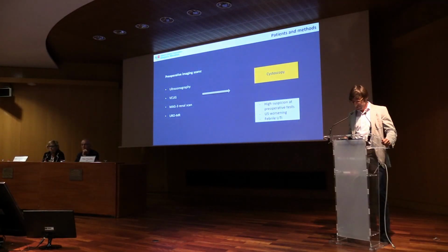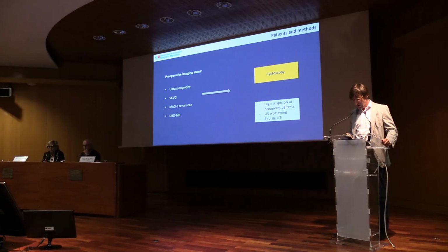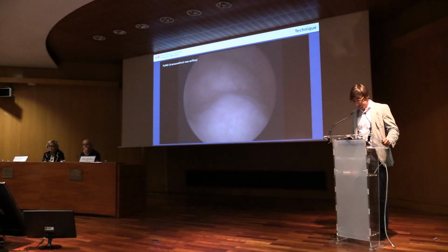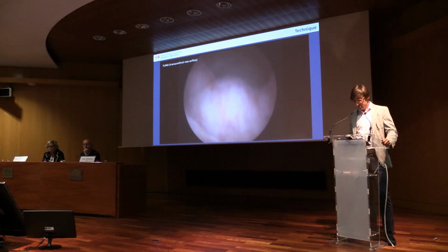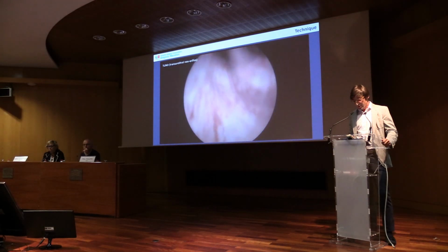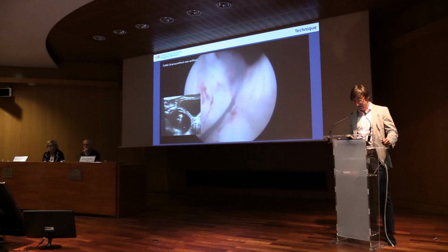Ureteral ectopia was always confirmed by cystoscopy, which was indicated in all of the patients with a high suspicion of ureteral ectopia, with ureteral hydronephrosis worsening during follow-up, and at least 2 recurrent urinary tract infections despite antibiotic prophylaxis. We performed cystoscopy with a 9.5 cystoscope. When the ectopic meatus is not found, the bladder is punctured where the ectopic ureter protrudes with a 3 French needle, under cystoscopic vision and ultrasound guidance.